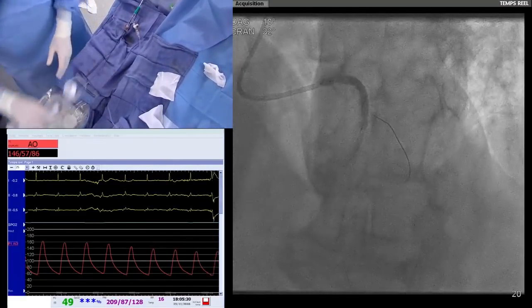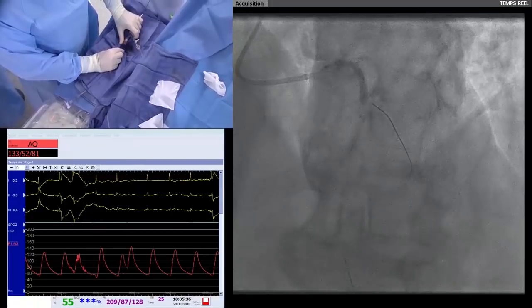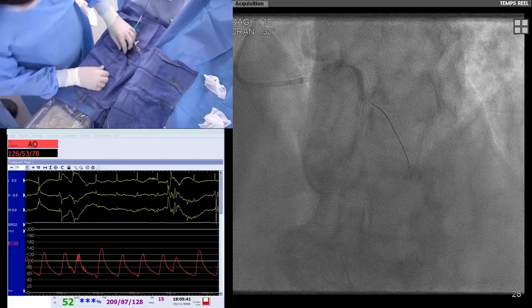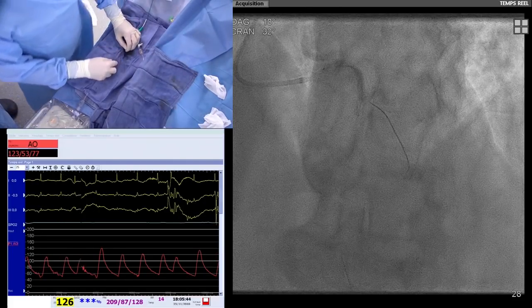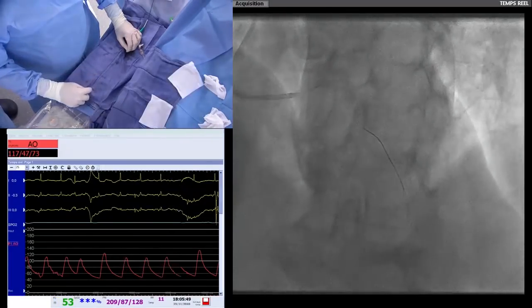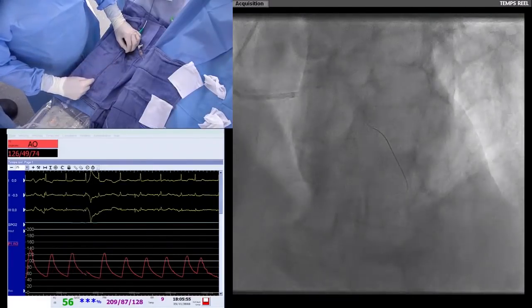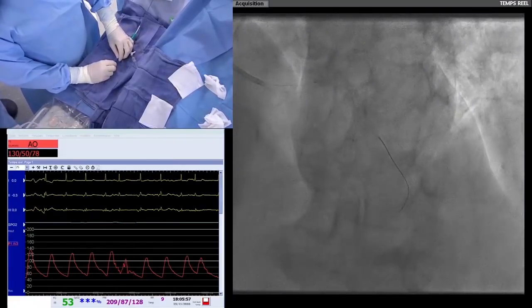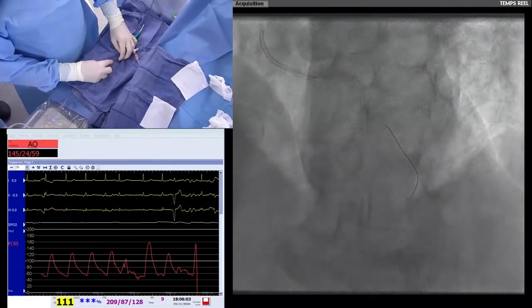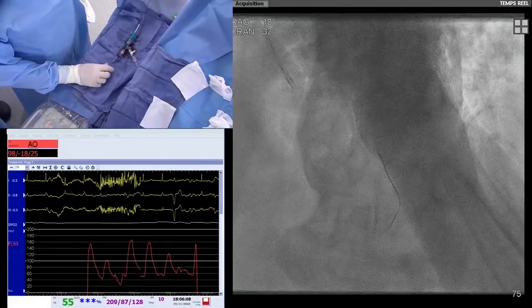8, and then I will manage the post dilatation using a larger balloon because I don't want to oversize the implantation after the diagonal. So I wait. The pressure is going up now. Okay, and I will pay attention to remove slowly the balloon because I have to avoid a deep intubation of the guiding inside the stent. I have to wait.